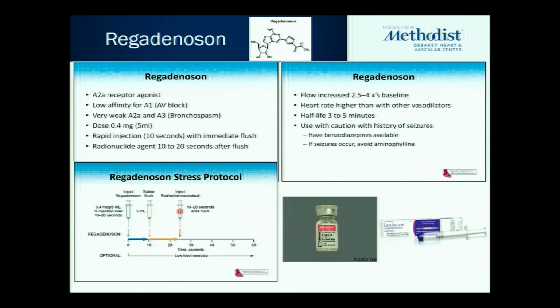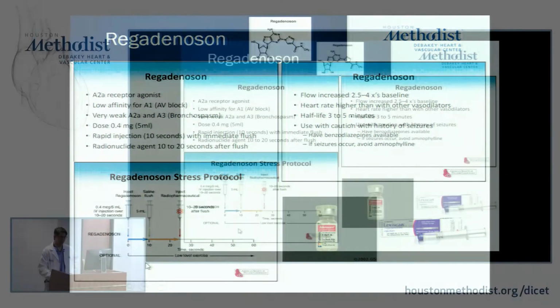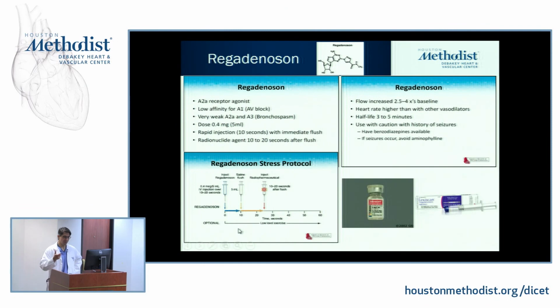It's very easy to give. This is actually our protocol here. Basically, it's already pre-packaged in a syringe. It's about 0.4 mg in 5 mLs. You inject it over 10 to 20 seconds.